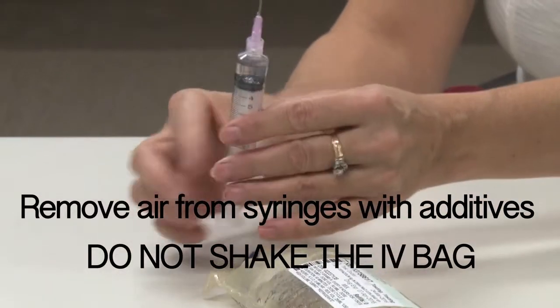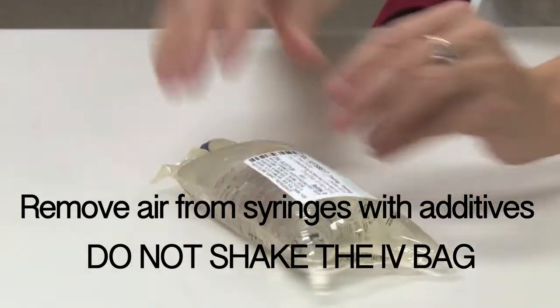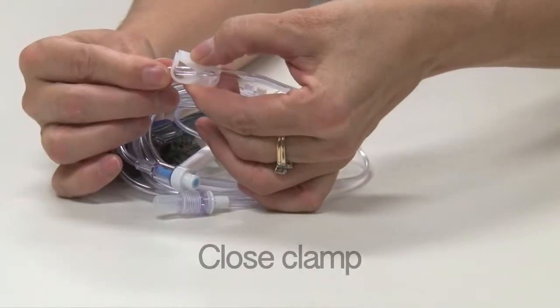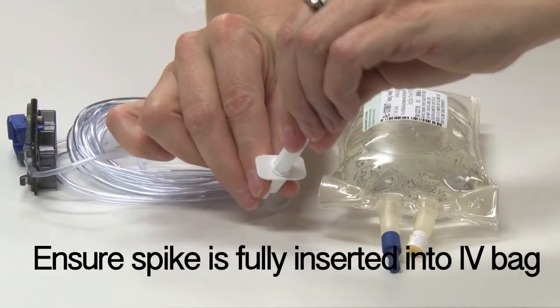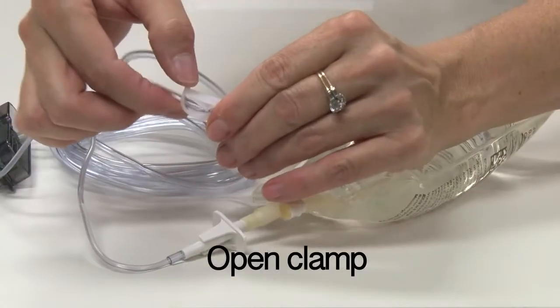Remove all air from the syringes prior to adding the solution to the IV bag. You can invert the bag or gently rock it — never shake the bag, as that will create additional bubbles. Close the clamp on the tubing set prior to spiking the IV bag. With the bevel up, spike the bag ensuring the spike is fully inserted into the port of the IV bag, then open the clamp.